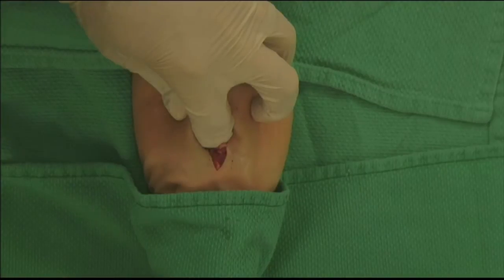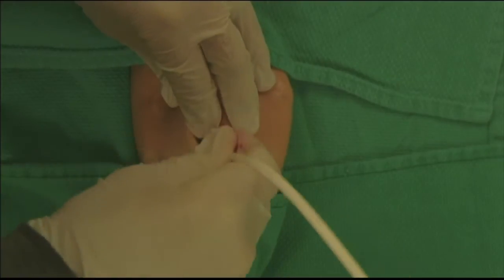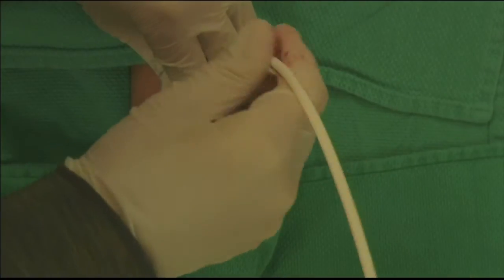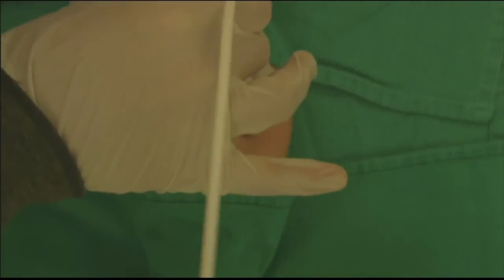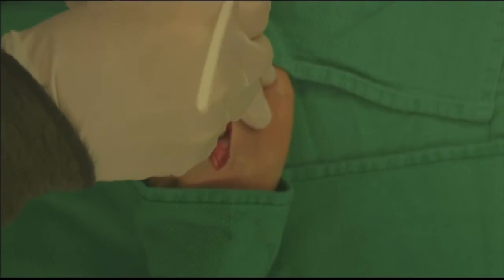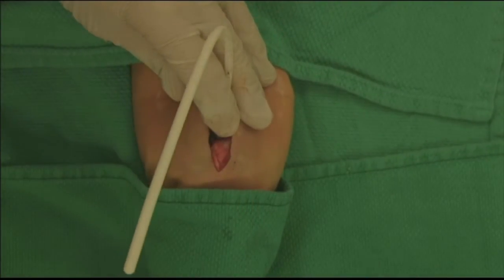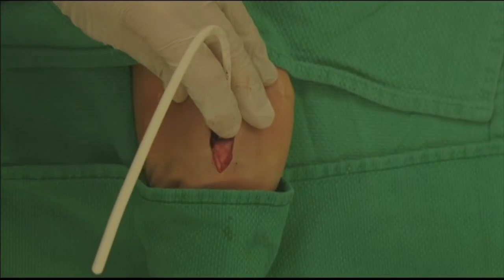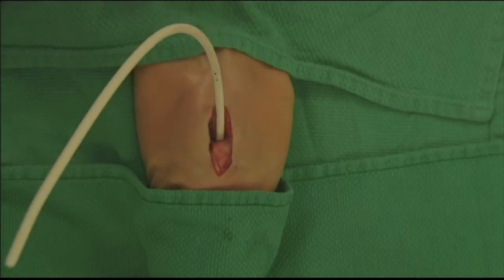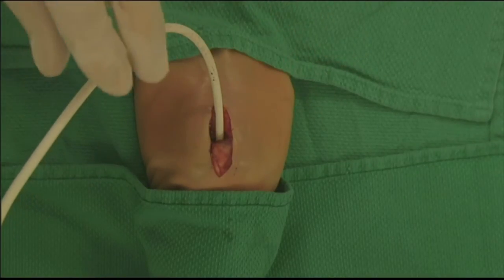The key then is to verify with your finger that you're actually in the right position — that's the key confirmatory step. Then take your bougie, in this case a pocket bougie with the coudé tip facing up, and start to insert it over your open landmark, down towards the feet. Feel for tracheal rings as you go. You can also feel holdup at a certain point — the bougie will just stop and you won't be able to advance any further. At this point you can let go; the bougie will stay. Your landmark and your airway is, so to speak, secured. You can take both hands off.